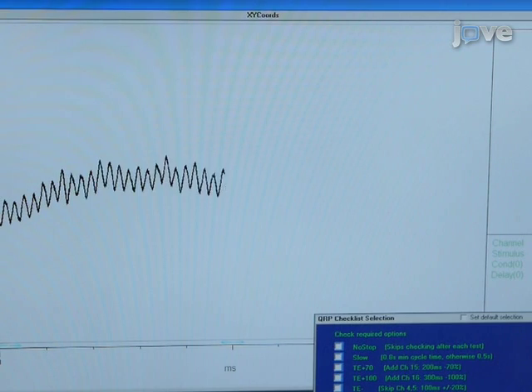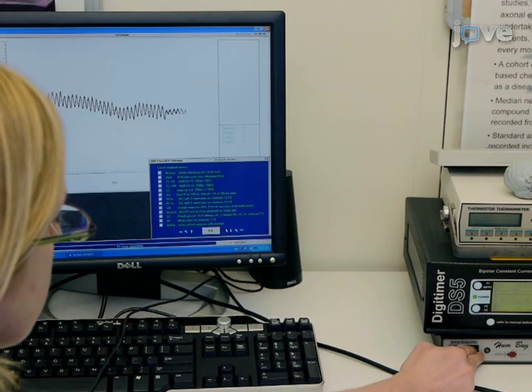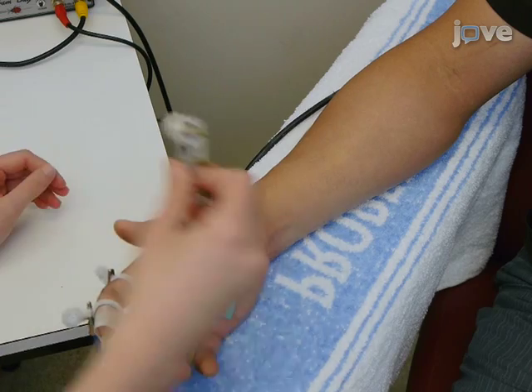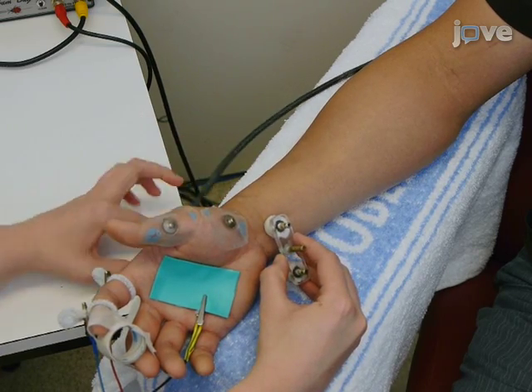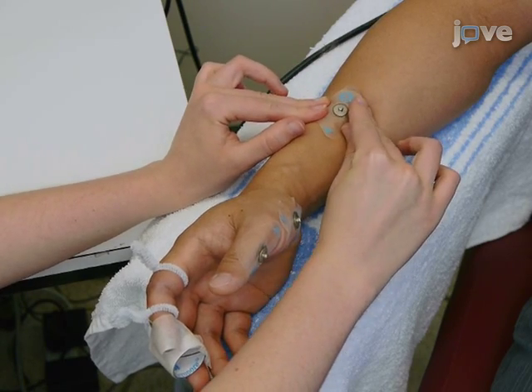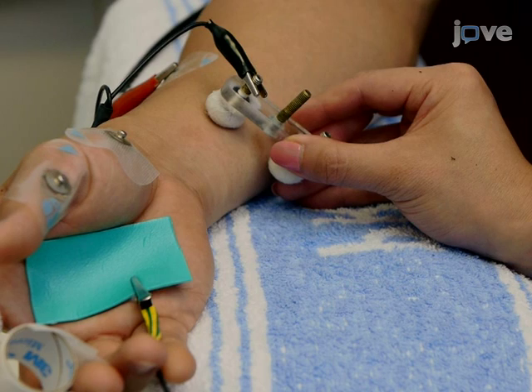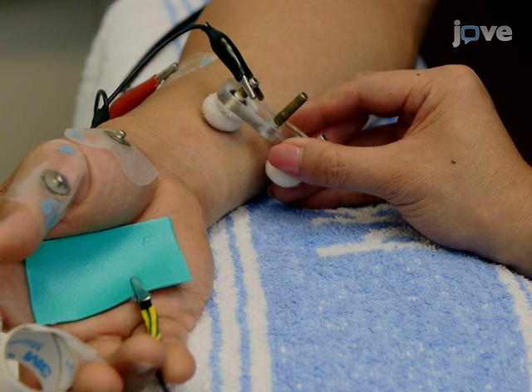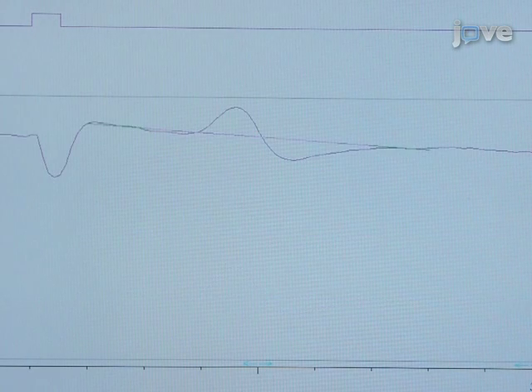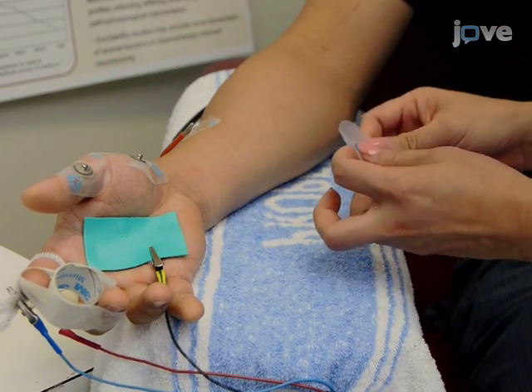At this point, be sure to remove as much electrical noise in the recording setup as possible using a HumBug 50 Hz to 60 Hz noise eliminator. Then place a repositionable stimulating electrode at the median nerve at the wrist. Place the anode electrode 10 cm proximal from the stimulating electrode over bone. Now stimulate the median nerve. Use the repositionable bipolar electrode to locate the site of lowest threshold, which will be used as the stimulation site for subsequent steps in this protocol. Once the site is located, place a non-polarizable electrode.